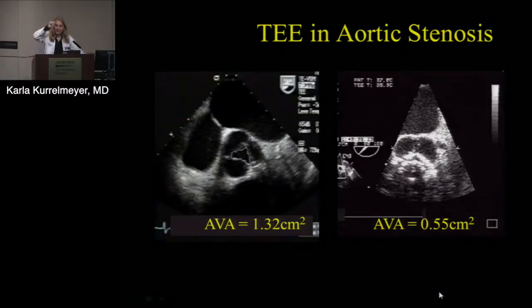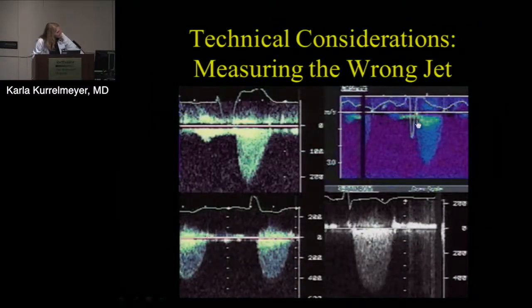So you see kind of like a little jet within the jet. I've never used that, but you're right on this previous picture. Let's see if I can bring it up. She's talking about, you know, see this? She's talking about this real dark thing, like maybe this is the left ventricular outflow tract flow, and then this is the stenotic jet flow. I mean, it may be helpful, but I've never found it routinely helpful for me. The other two things I've found much, much more helpful when trying to interpret these blind jets.